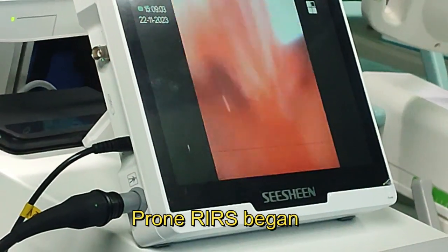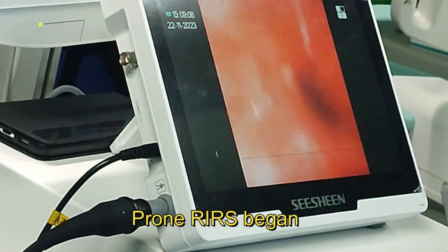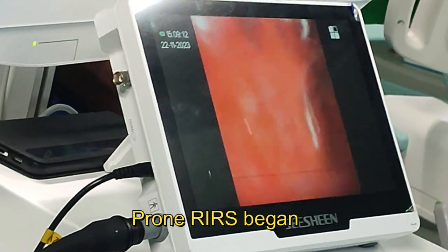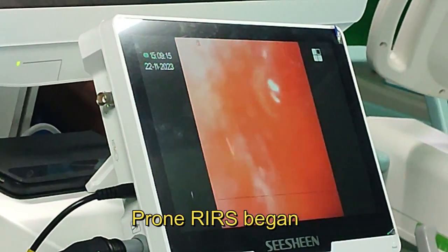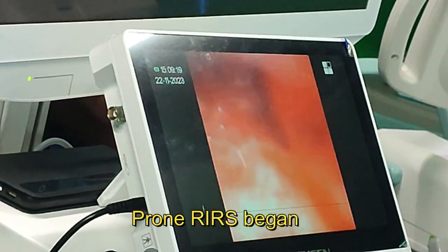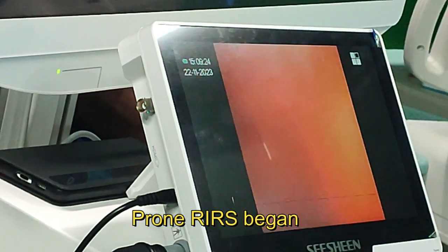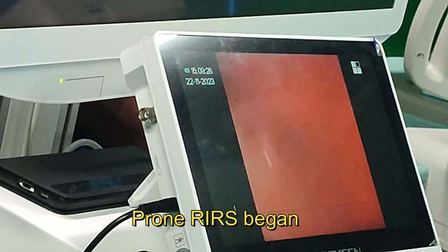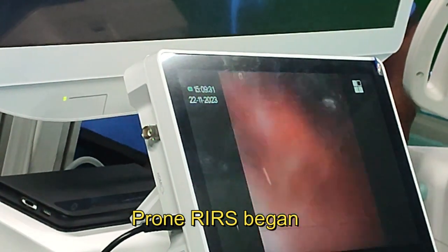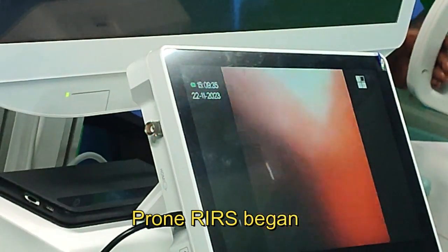Flexible from below. Yeah, choose the plastic. Choose the access sheath rather, through the outside sheath from below. Yes, an access sheath. Okay, I guess since there was a guide wire installed, it was a urinary catheter. I see. So that's the upper pole.